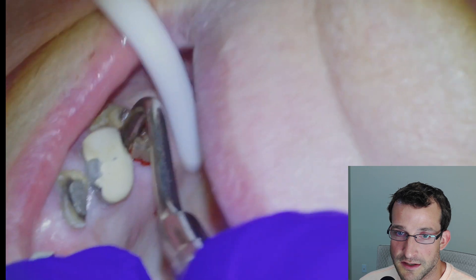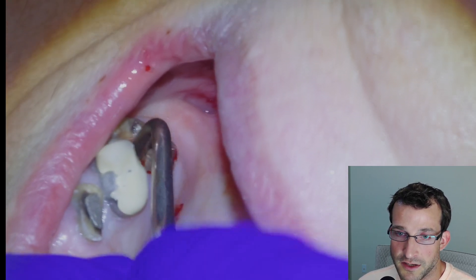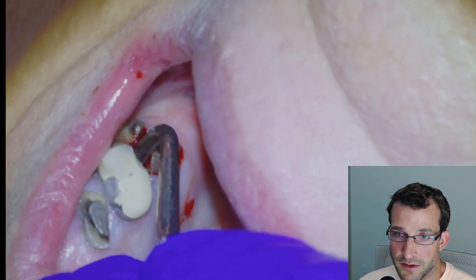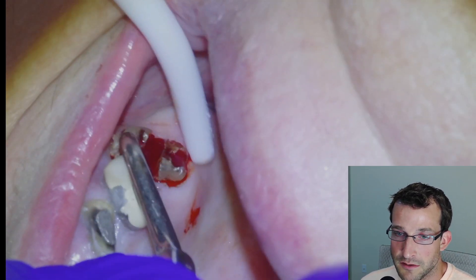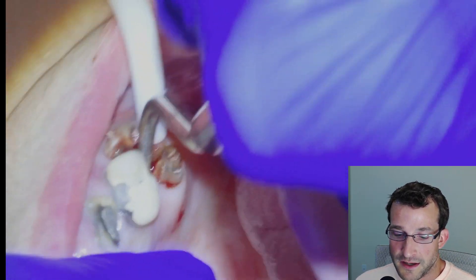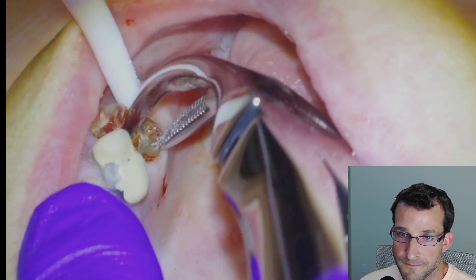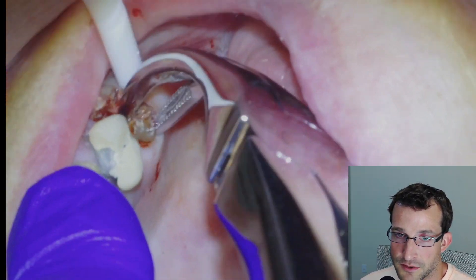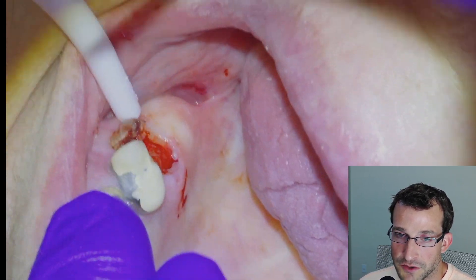Once we're satisfied with our sectioning, we'll grab the root tip pick and basically just get it as deep as we can, then start elevating the palatal root from the buccal roots. We have reasonable luxation there, so we're going to grab a root tip forcep and see if we can grab the palatal root — which we're fortunately able to do. If we had difficulty, we could just remove more bone.